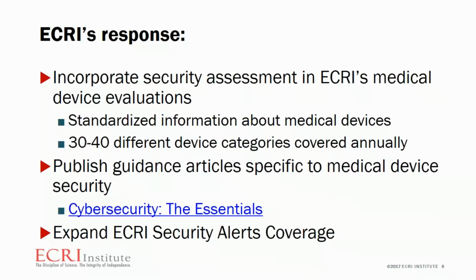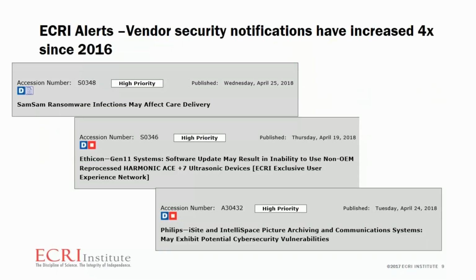And finally, we've expanded ECRI Institute's coverage of security alerts through our alerts tracker recall management software. So since 2016, we've seen a fourfold increase in security alerts overall. Again, largely driven by the fact that medical device vendors are submitting more and more security notifications that are publicly available. And we've established methodologies on how to move forward and address these cyber alerts.